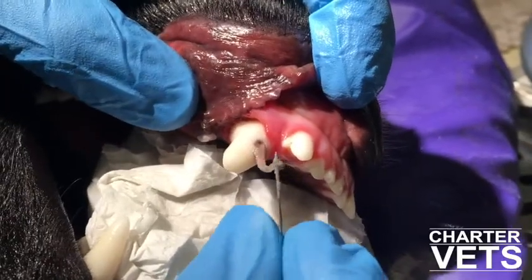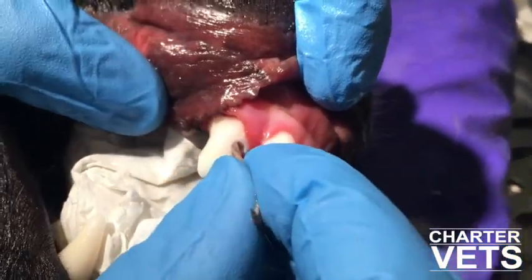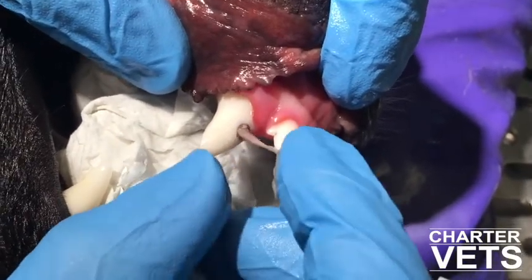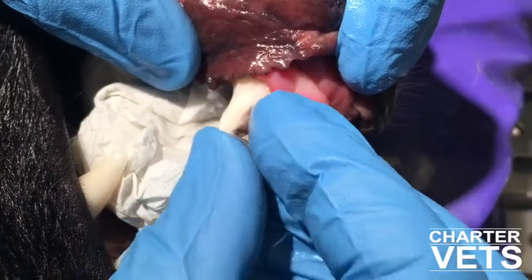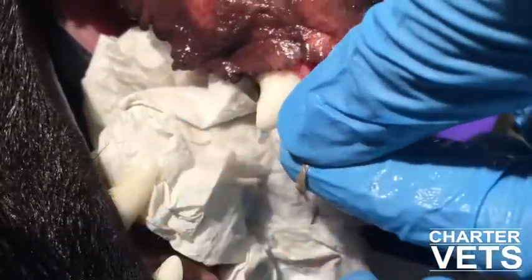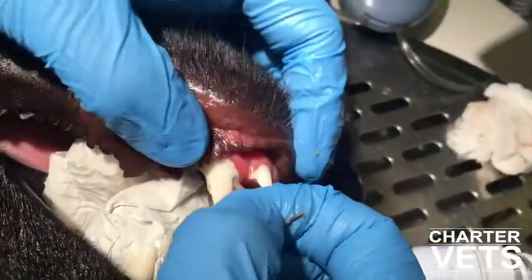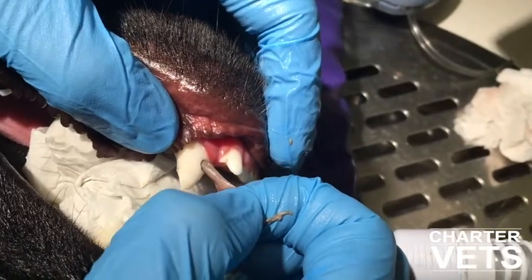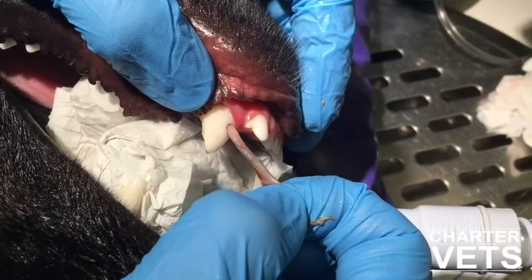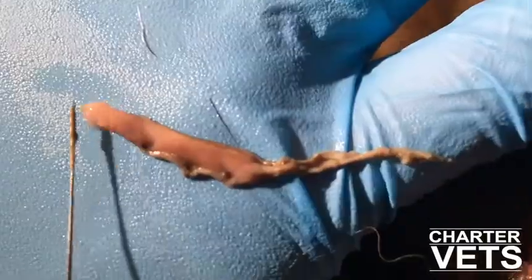So step one of Rufus's therapy was to remove the pulp, cleanse the infected canal, and place a temporary dressing where the pulp once was. Which means we fill up the canal with a material which will just cleanse that whole environment and get rid of all those microbes that we don't want down there. Good grief. It's coming. That's incredible. Smells worse than it looks.